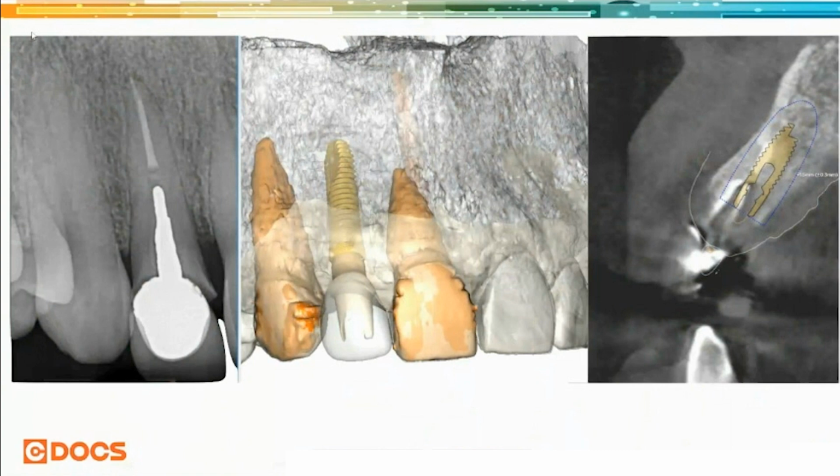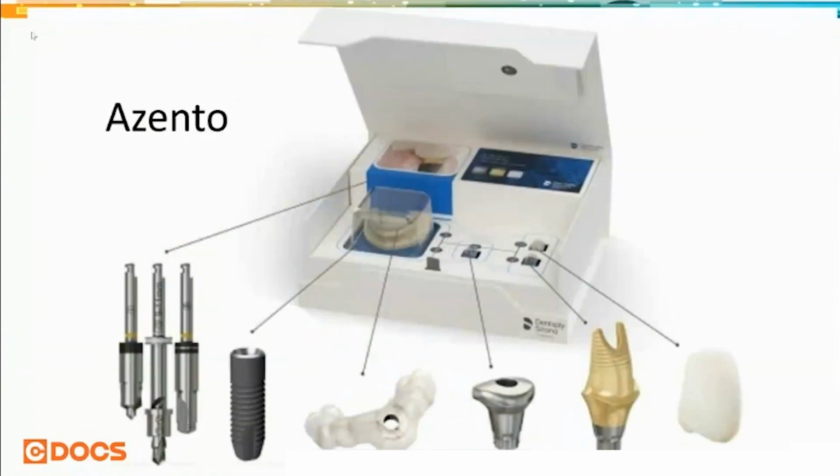And so in my most recent case, I had a few corrections that I wanted the lab to make. So I made those comments. They sent back a treatment plan that I then approved. And then once that treatment plan was approved, they sent me this box. And I'll go back to this slide.